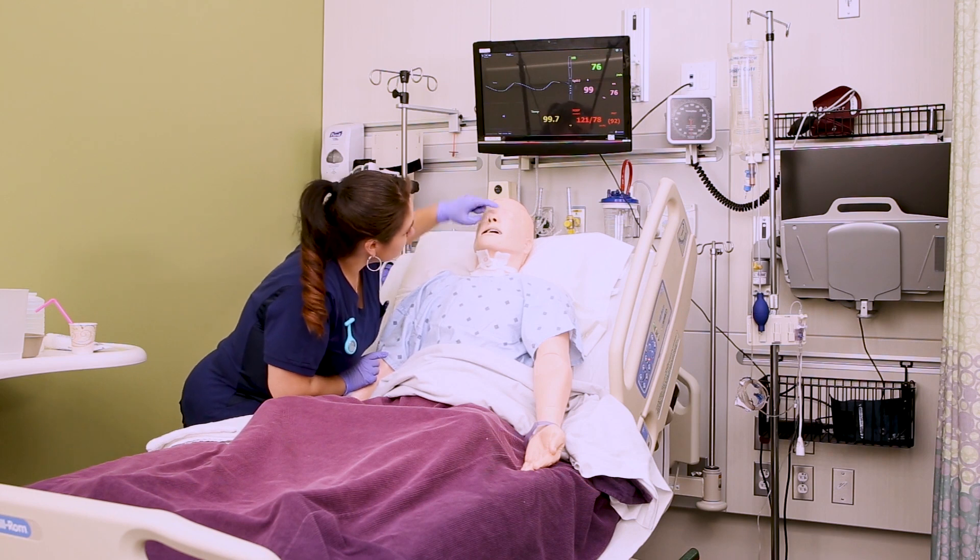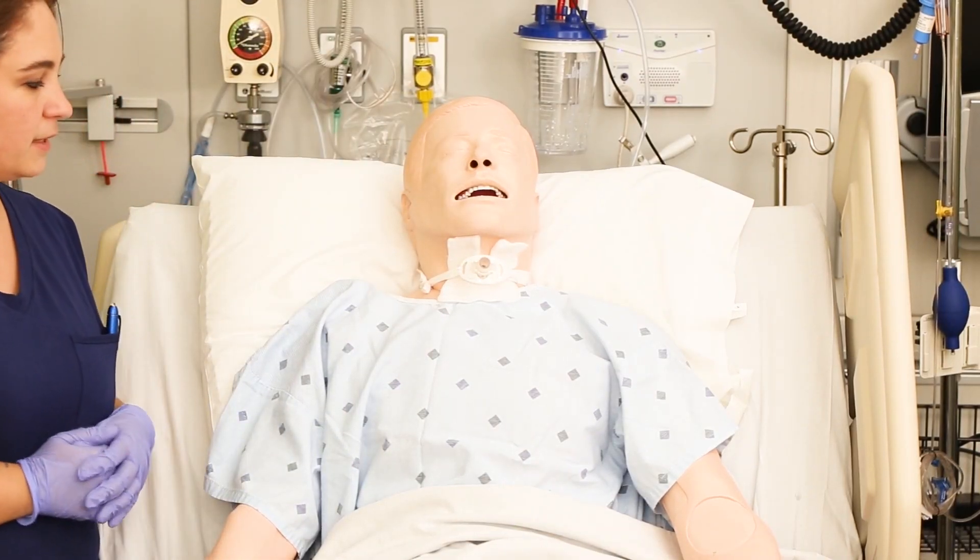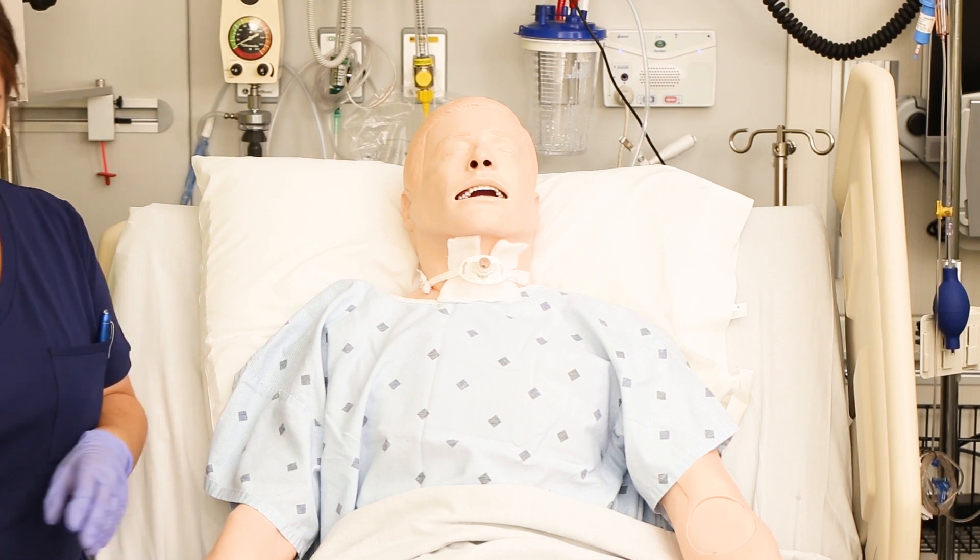Before you get started, you want to make sure that you've determined which nare is more patent and that the patient doesn't have a deviated septum, so you know which nare to use.